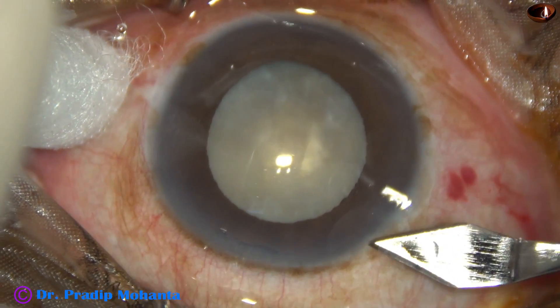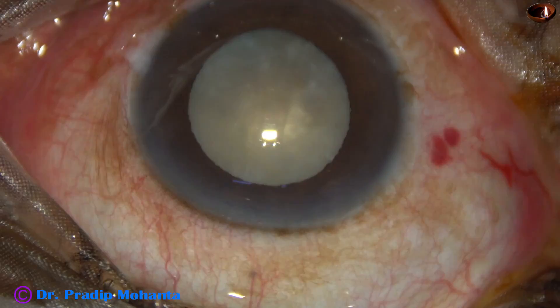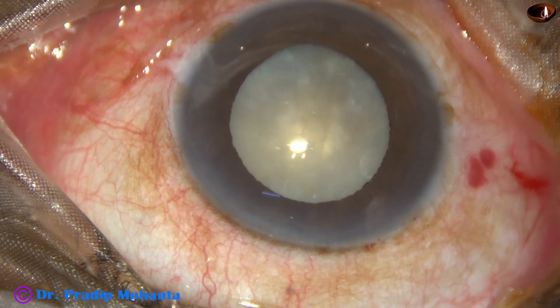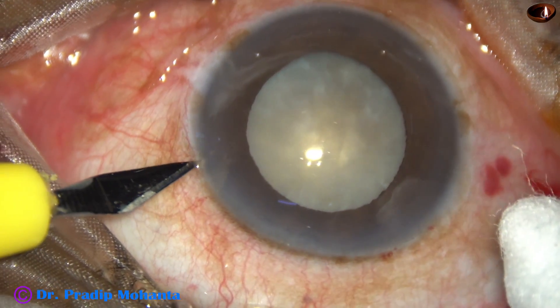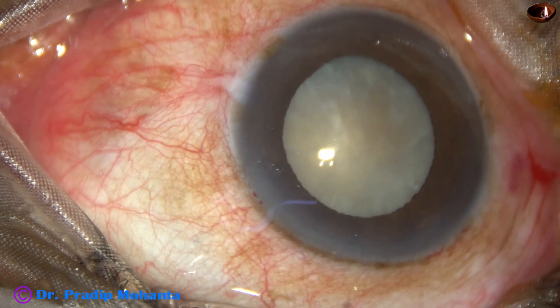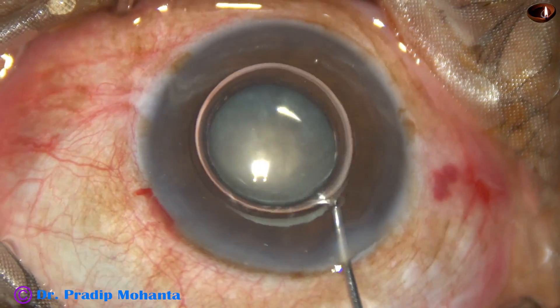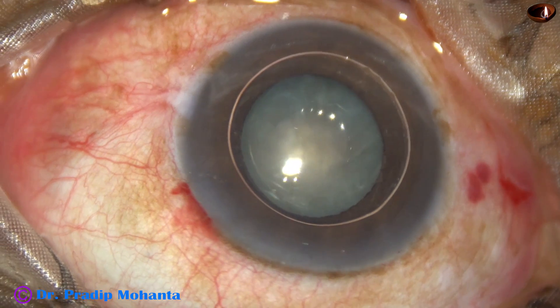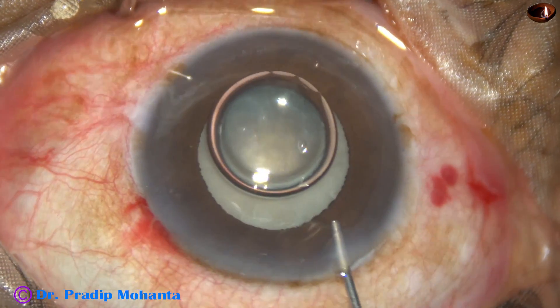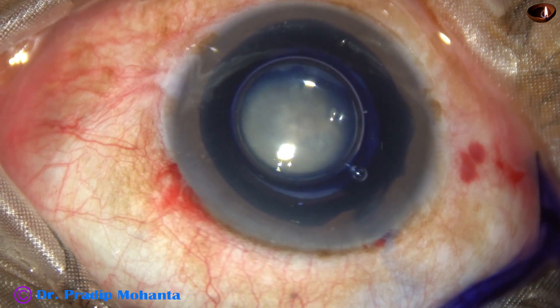This is the main incision with a 2.8 mm steel keratome. Phacoemulsification has been planned for this case. A side port is made on the left side of the main incision. An air bubble is injected to fill up the anterior chamber, and trypan blue dye is applied underneath this air bubble to stain the anterior capsule.